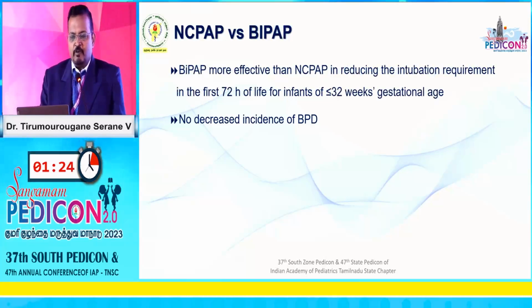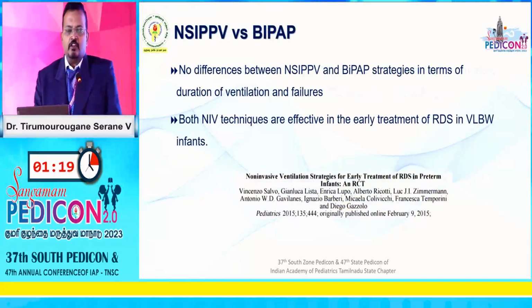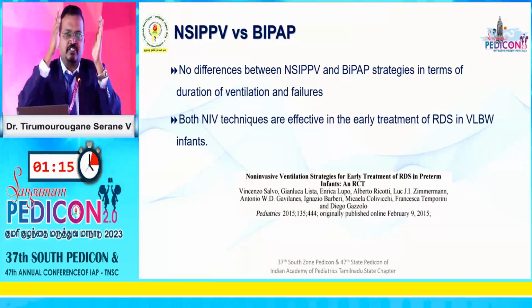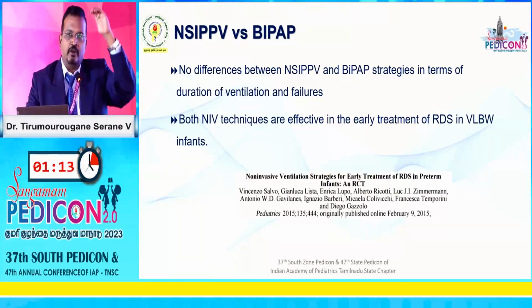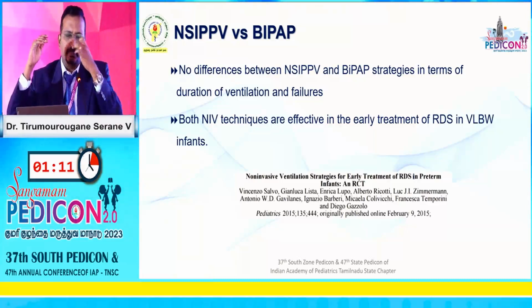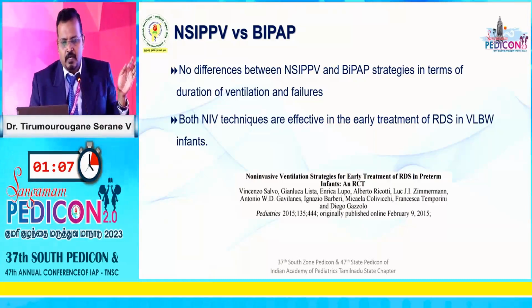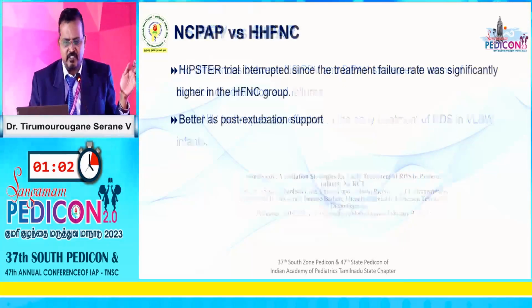What about BiPAP, one of the other modes? Very similar story. Then they thought, why not compare between BiPAP, which is basically fixed. You have a fixed inspiratory time, fixed expiratory time, and during inspiration you get a higher flow, and during expiratory time a slightly lower pressure. Then you compare between the two, and with the synchronized mode, again they found it does not make a very big difference.